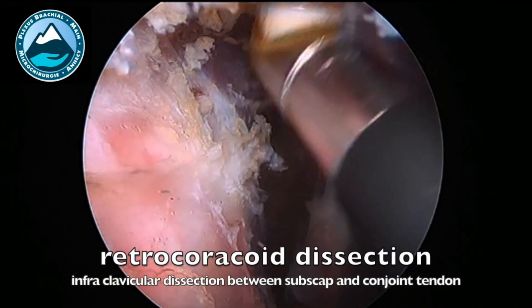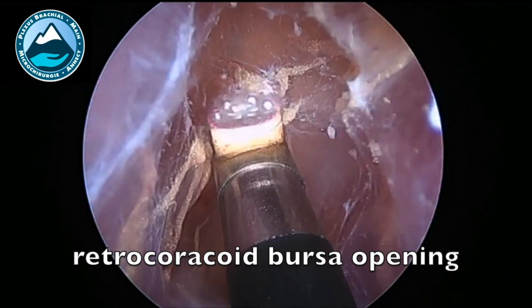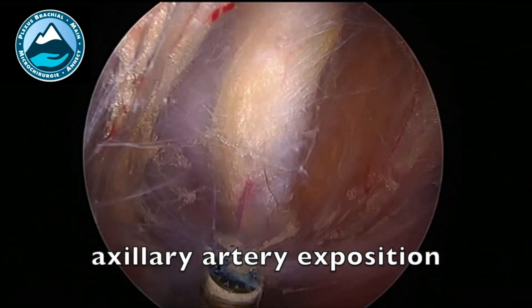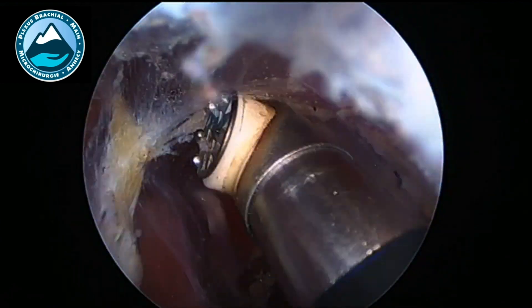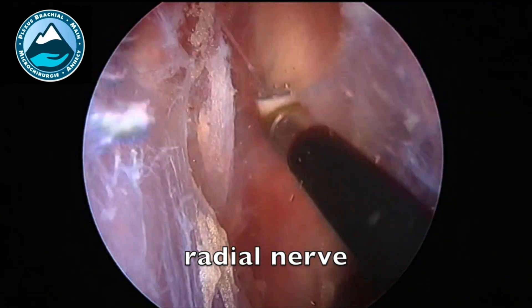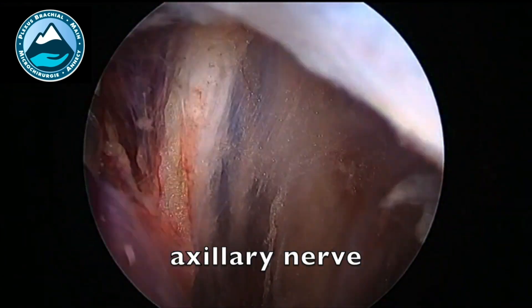Then we move to the infraclavicular exposition, and I like to start with the retrocoracoid dissection. What's very important there is that you have to remove the retrocoracoid bursa. Then you expose the axillary artery and the radial nerve, which is really close to the axillary artery, and the axillary nerve.